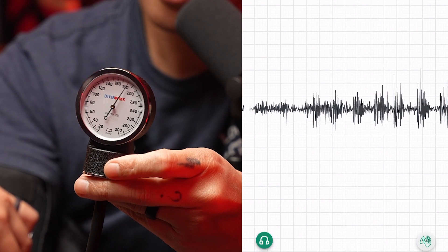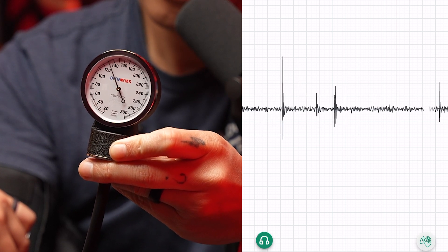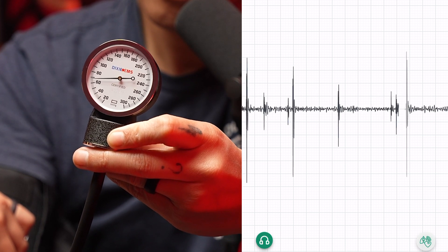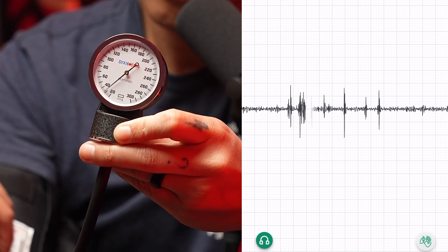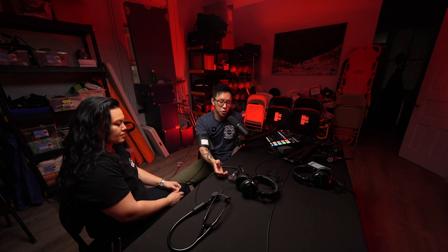So Russ got 110 over 78. Let's do it one more time. And 100 over 78. Hope you got something out of it — that was just the auscultated blood pressure.